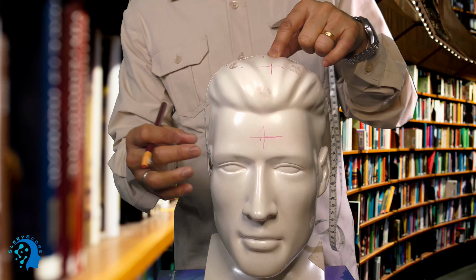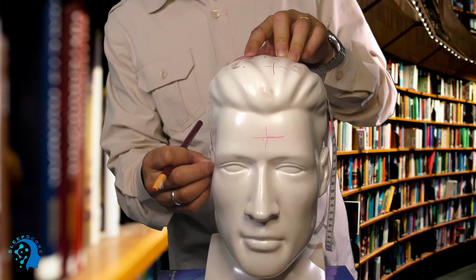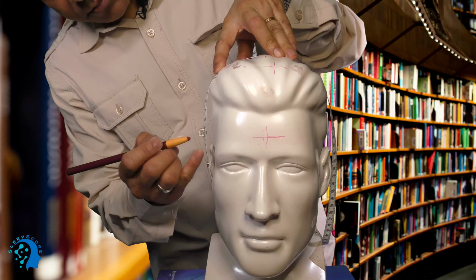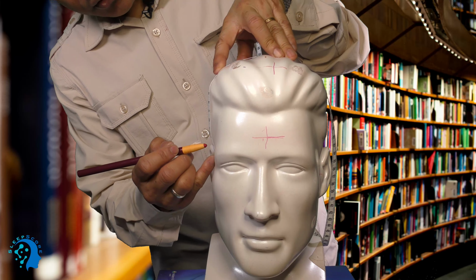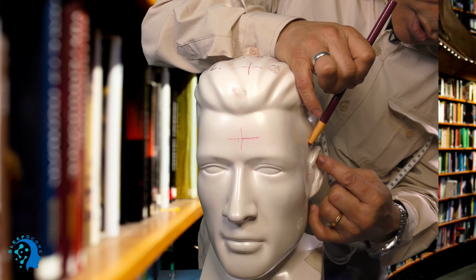So when I did half of 36, which is 18, then I got a cross over here. Now the same way, because this is also 10-20 measurement, you have to go up 10%, so of 36, you have to go 3.6 right here, okay? This is 10%, and the other side also you have to go 3.6.